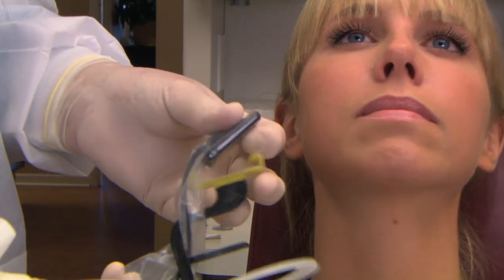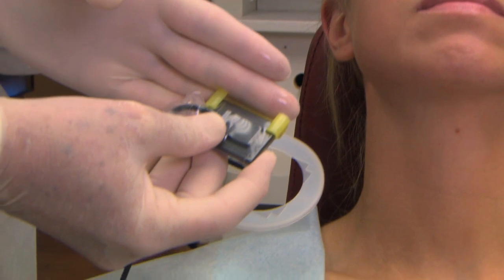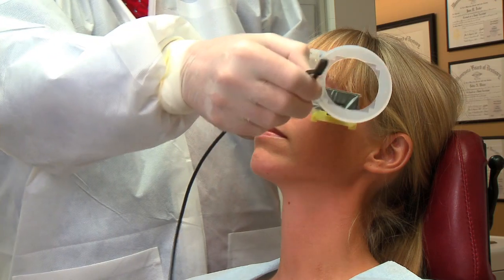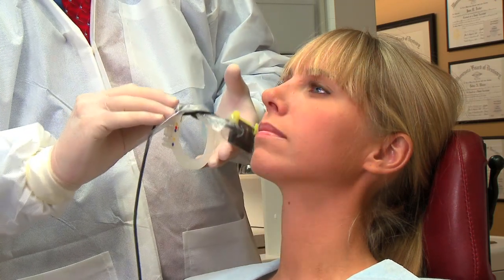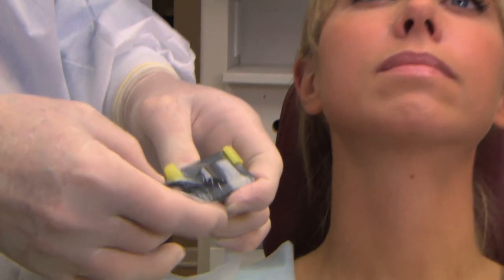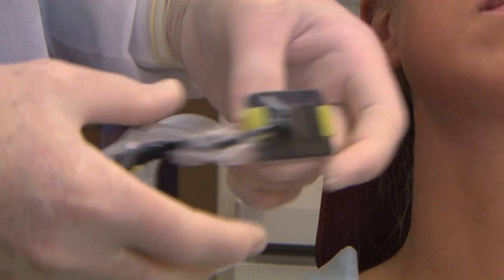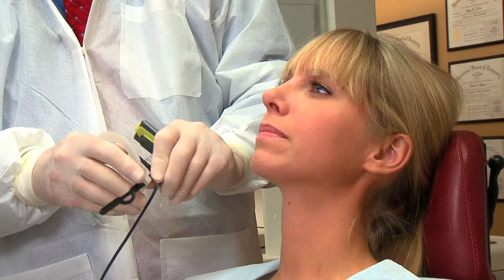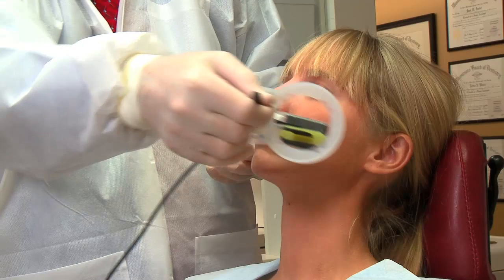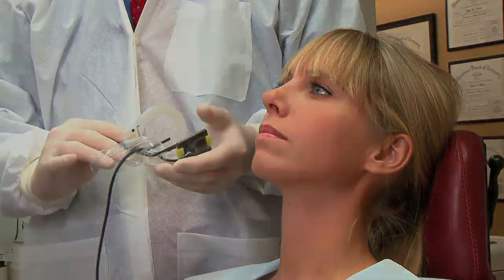Slide the sensor out and move it to the opposite side. Make sure that the sensor is positioned about halfway in the claw. Change the ring to the opposite side. Then you can pick up your uppers and lowers. In addition to your posterior PAs, you can also use this holder for horizontal bitewings. Slide the sensor to the center for the bitewing position and move the aiming ring to the bitewing position. Then you can pick up 1, 2, 3, or 4 bitewing positions, all 12 posterior positions with just one holder.